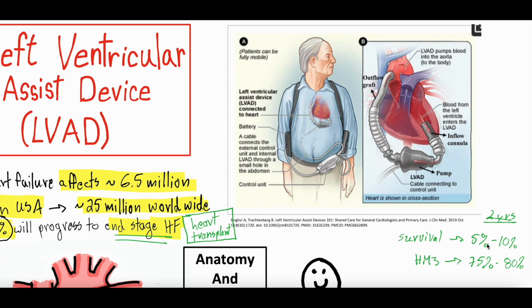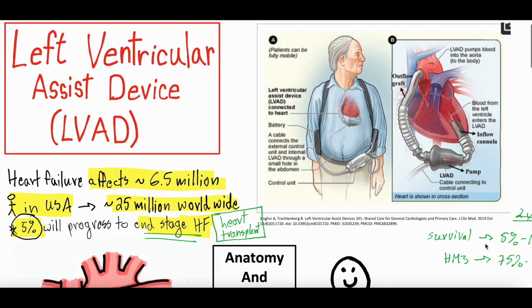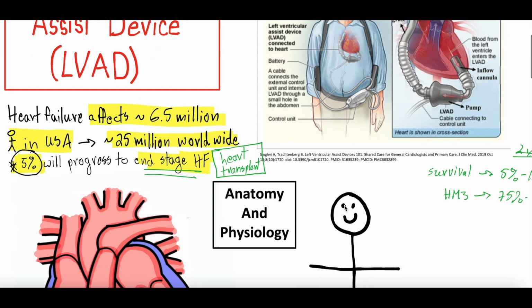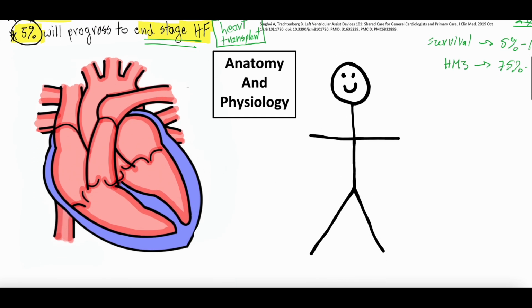Quality of life and all those kinds of things benefit from having this left ventricular assist device. So as you can see, this device does seem to help people. It's really interesting though. We're going to come back up to this picture to talk about the components of the device itself. I want to start with a more simplistic drawing on the anatomy and physiology. And to understand what an LVAD is doing, we have to understand how the heart works.